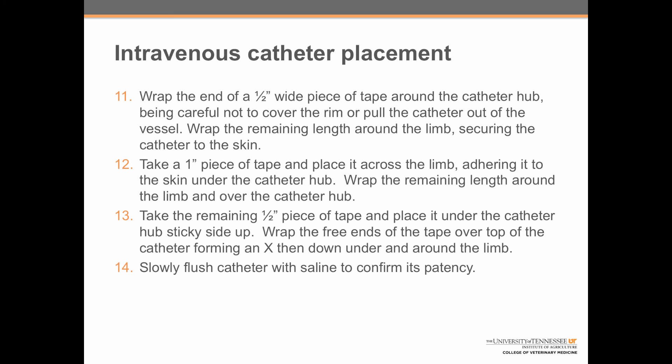Step 11: wrap the end of a half-inch wide piece of tape around the catheter hub sticky side up, being careful not to cover the rim or pull the catheter out. Wrap the remaining length around the limb securing the catheter to the skin. Step 12: take a one-inch piece of tape, place it across the limb adhering to the skin under the catheter hub, then wrap the remaining length around the limb and over the hub. Step 13: take the remaining half-inch piece of tape, place it under the catheter sticky side up, wrap the free ends over the top of the injection port forming an X, then down and around the limb. Step 14: slowly flush the catheter with saline to confirm its patency. Now it's your turn.